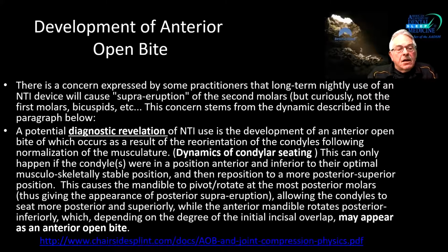A potential diagnostic revelation of NTI use is the development of an anterior open bite, which occurs as the result of the reorientation of the condyles following normalization of the musculature. He calls it the dynamics of condylar seating. This can only happen if the condyles were in a position anterior and inferior to their optimal musculoskeletal stable position.